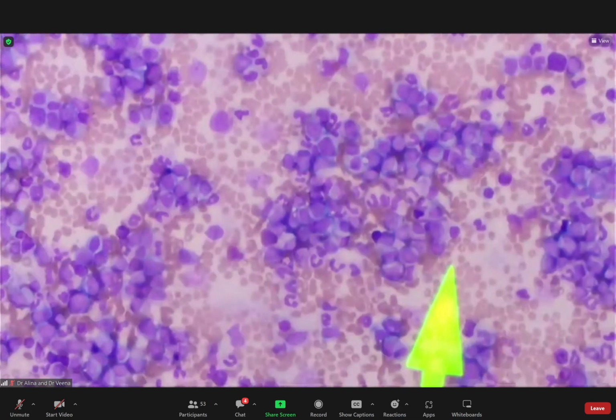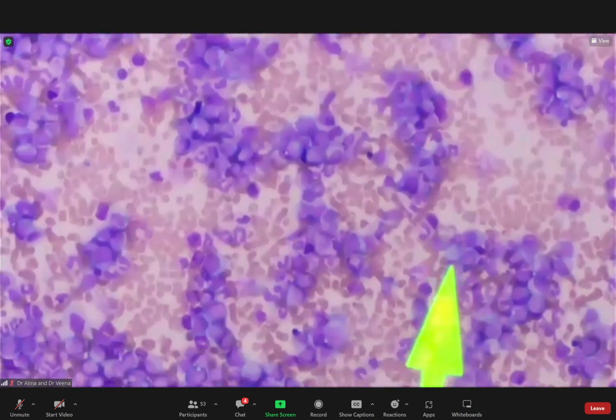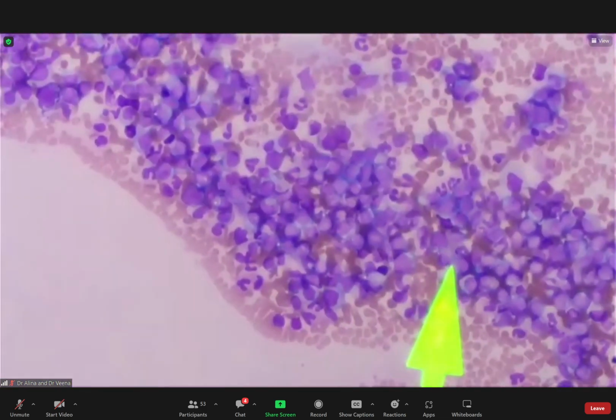So even in exams, and this is especially for the exam, I'm not sure about the other, it's for clinical. Also the same: you write what you see. You miss out hyperleukocytosis, you just describe that there are myelocytes and bipeak maturation, but you don't actually say there's hyperleukocytosis, which is a shame. The key is hyperleukocytosis, which is what CML is, right? Hyperleukocytosis with bipeak maturation, or a peak in your myelocytes and your neutrophils.